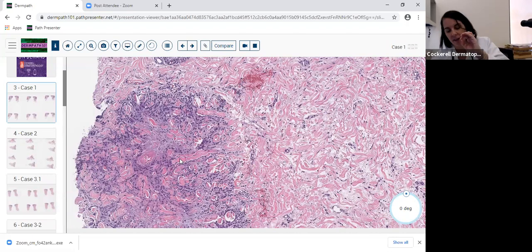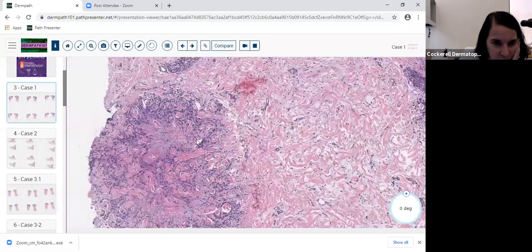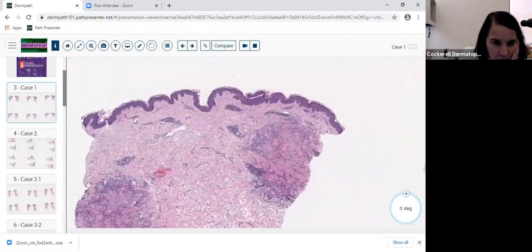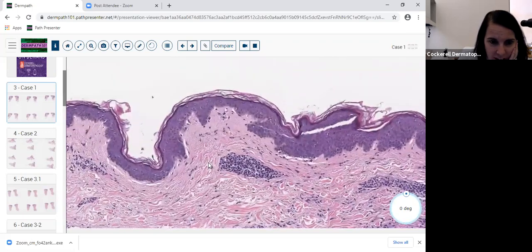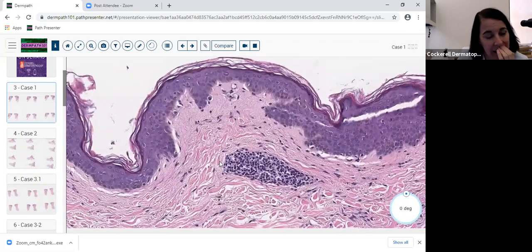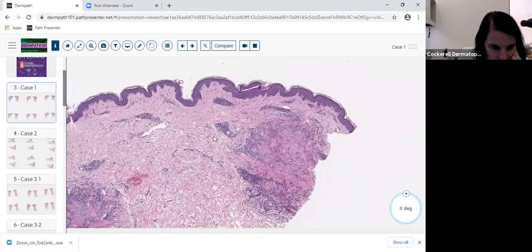We had on the clinical, they said rule out GA. So the take home point on this slide is please, if you are suspecting GA clinically, do not do a shave, do a punch, because we need the dermis. Otherwise, I'll give you the answer. The answer I'll give you is superficial perivascular dermatitis. And these are not the typical features of GA in this area if all I have is a shave. So it's very important to go deeper and get dermis if you're suspecting GA.